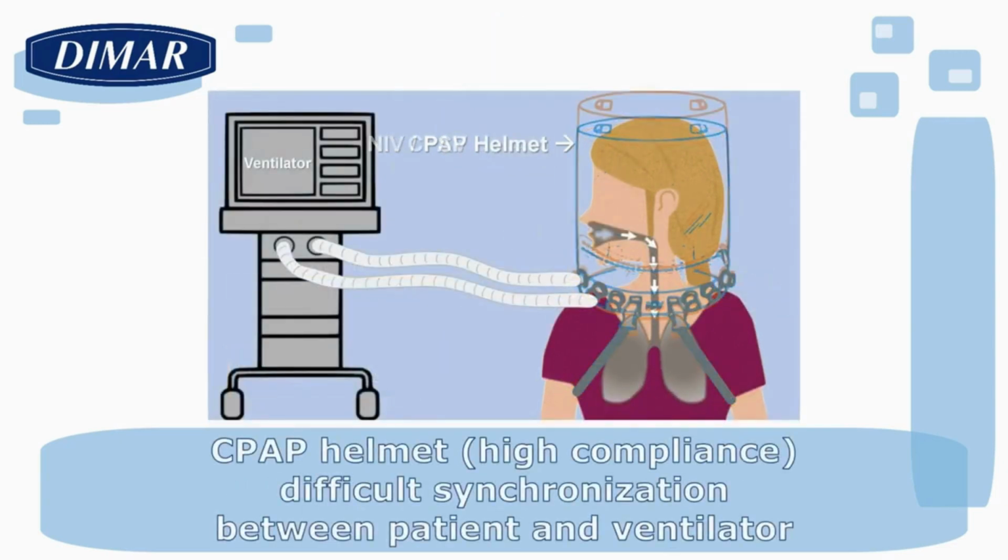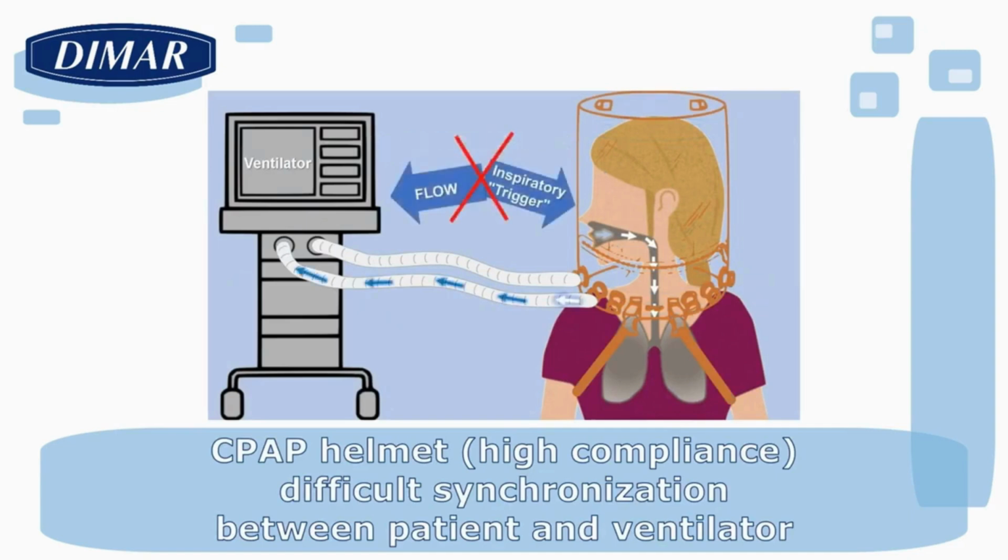On the contrary, it might be challenging to synchronize a patient with a ventilator in PSV mode using a CPAP helmet because of the high compliance, volume and softness of the interface.